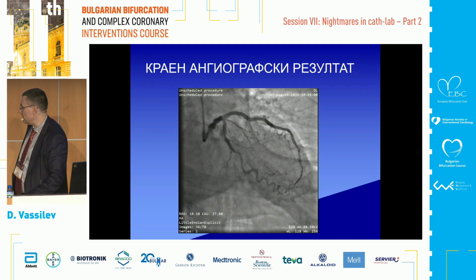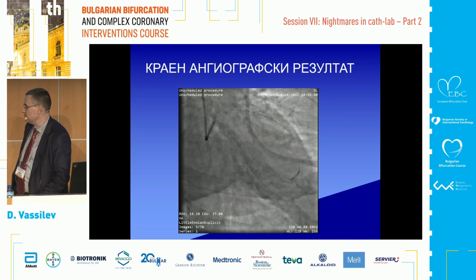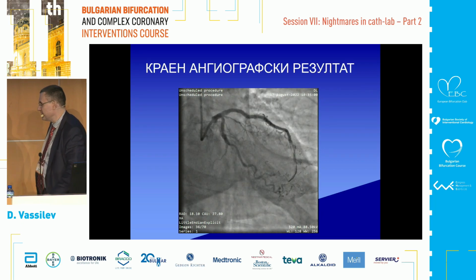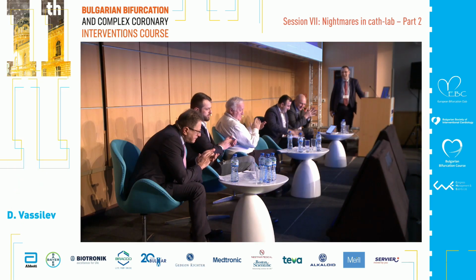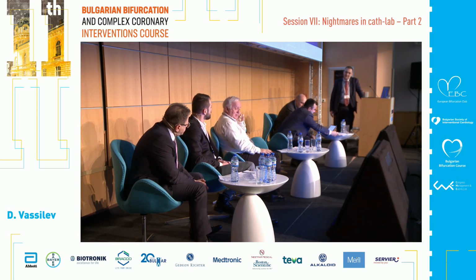So this is the case. It's open for discussion. This is the first time I see that.